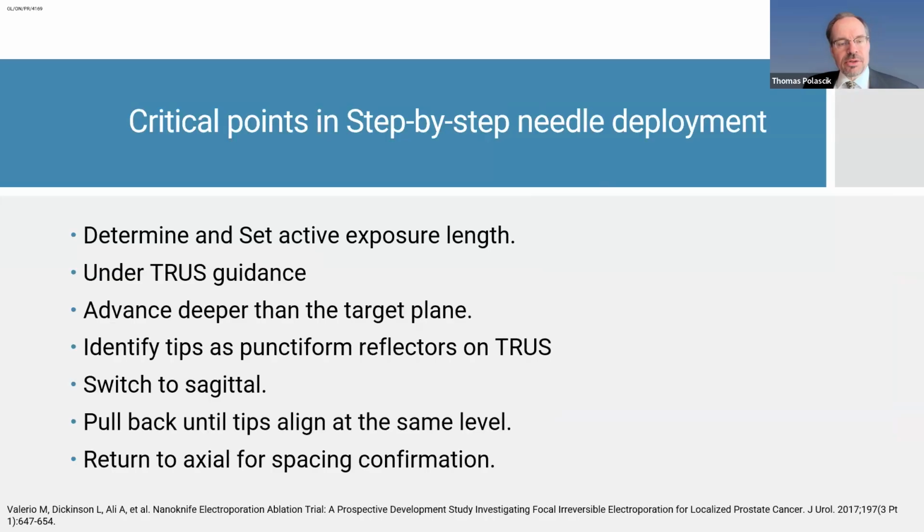We typically do our measurements first. I use Urinav, we do our sweep. We get everything lined up, and then we determine how long we want our needle active tip deployed. So we set all these first.